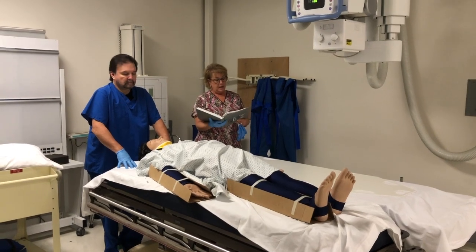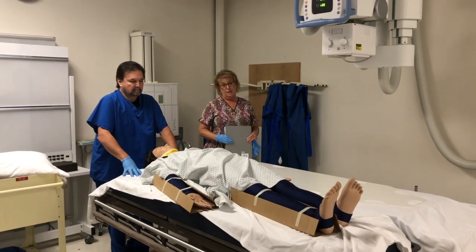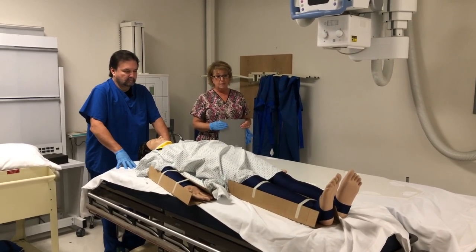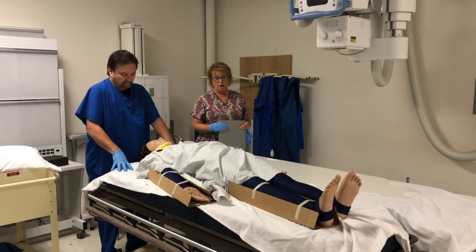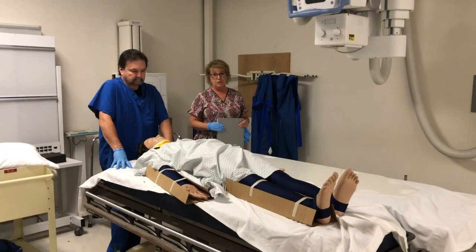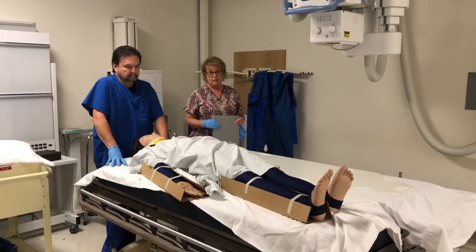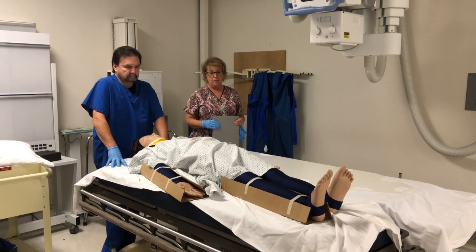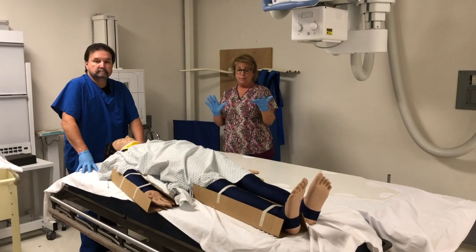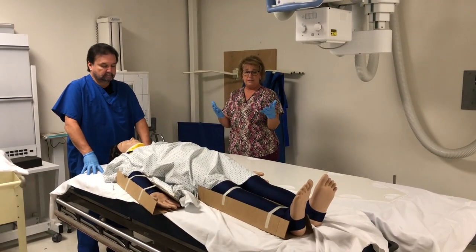And if you work in a level 1 or a level 2, even a level 3 trauma center, you're going to encounter patients who are in some type of immobilization precautions. And so we're going to demonstrate a few considerations today that you should have when moving and positioning a trauma patient. It's important in trauma cases to wear gloves.